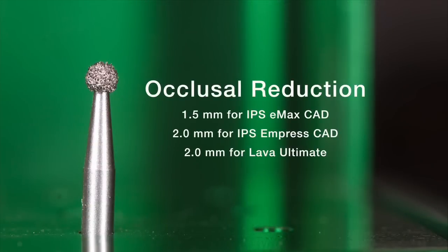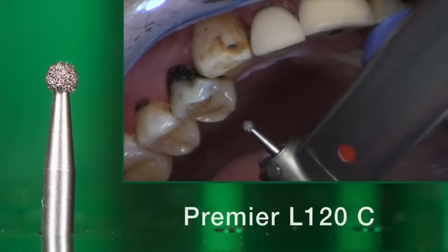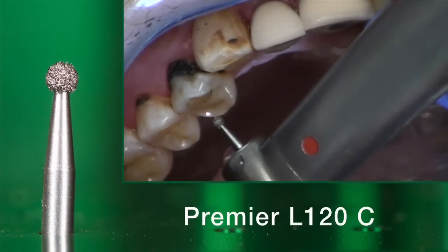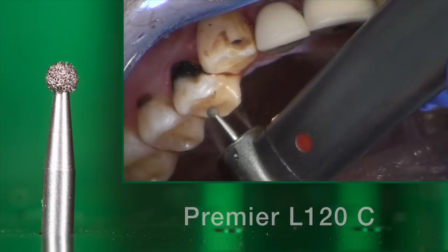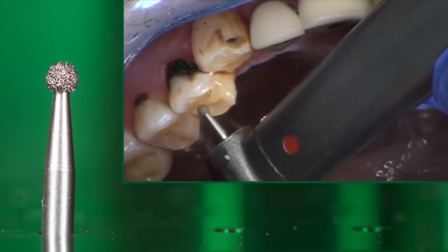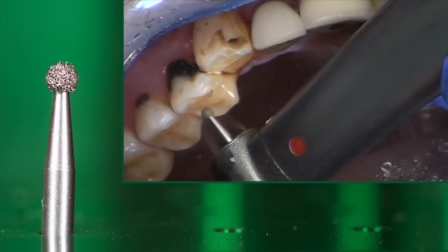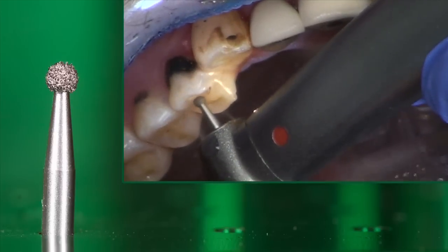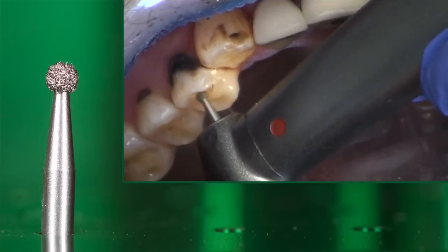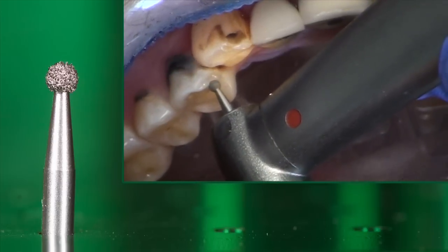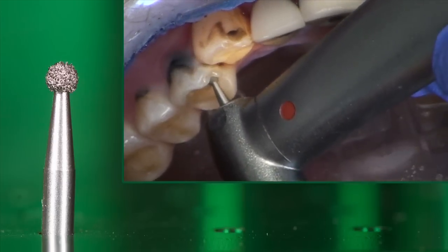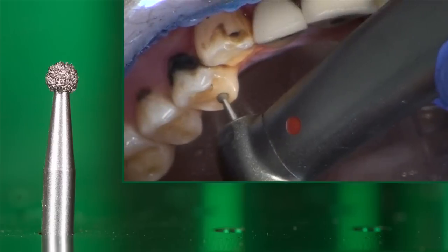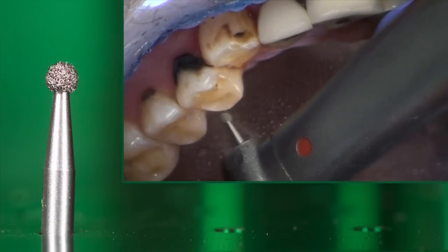The first thing I'm going to consider is the occlusal reduction required for this particular material. Because we're using Emacs CAD, we need about a millimeter and a half of occlusal reduction. In order to accomplish this accurately, I'm going to use a round burr — a Premier L120C. When I sink this burr down into the occlusal surface, I'm reducing the occlusal surface by about a millimeter and a half. By creating dots across the occlusal surface, I have a reduction guide that I can then connect using my secondary burr, which will be a round end tapered burr. The first step is simply to sink this burr down into the occlusal surface of the tooth.